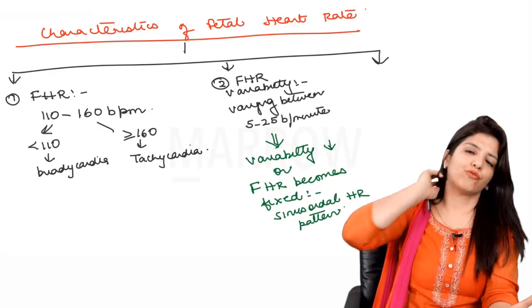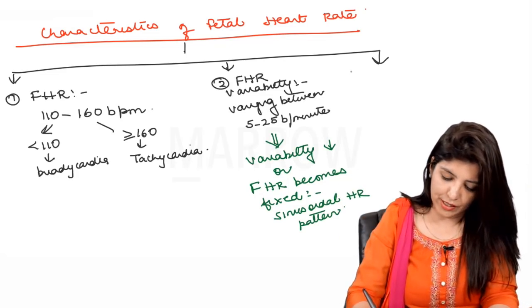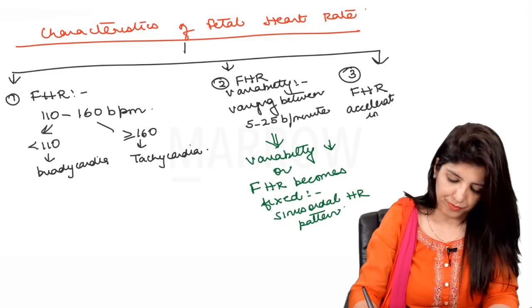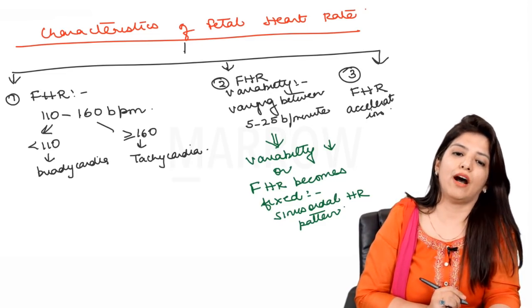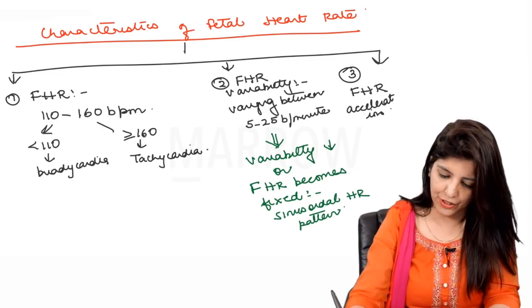So, one characteristic of fetal heart rate was the fetal heart rate itself. The other thing is fetal heart rate variability. A third characteristic of fetal heart rate is fetal heart rate acceleration. So let's talk about fetal heart rate acceleration.